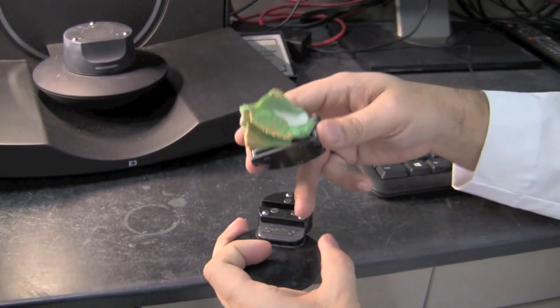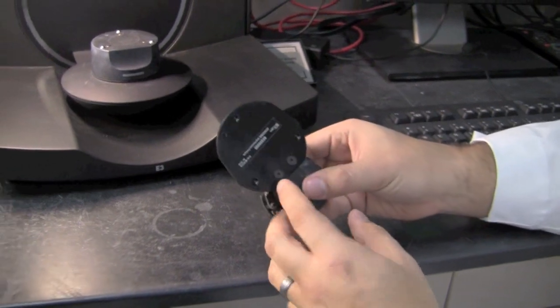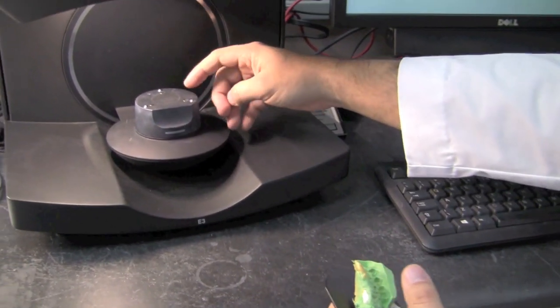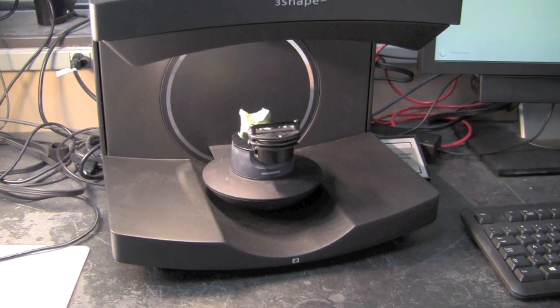You can see here it's got these three magnetic balls that match the three indentations. We're going to go ahead and set that on there. The same thing here — we've got these three indentations and the three magnetic balls in the scanner, so we're going to make sure that everything matches up. And then we're going to go ahead and scan.